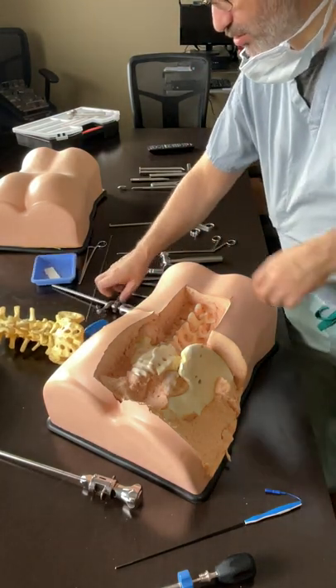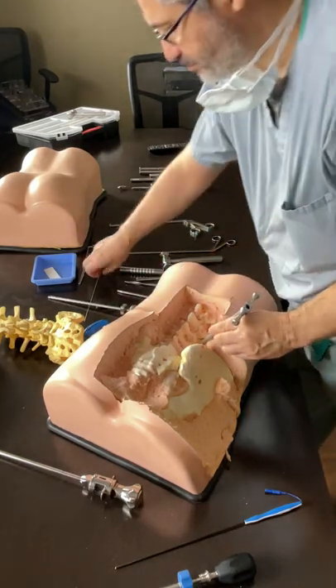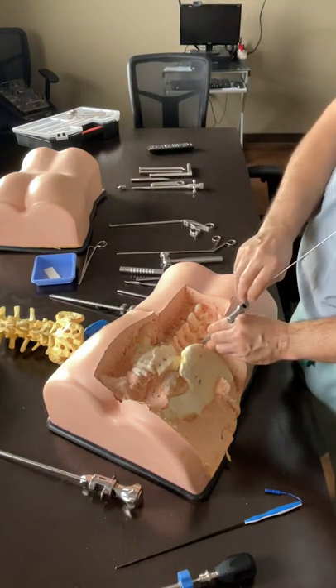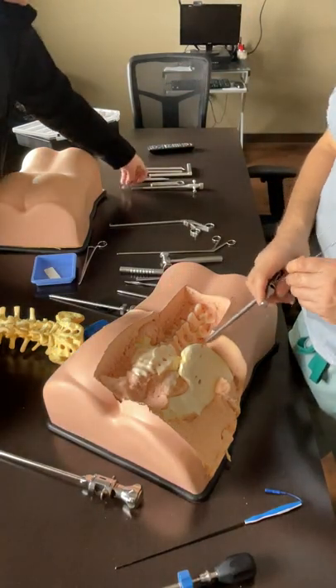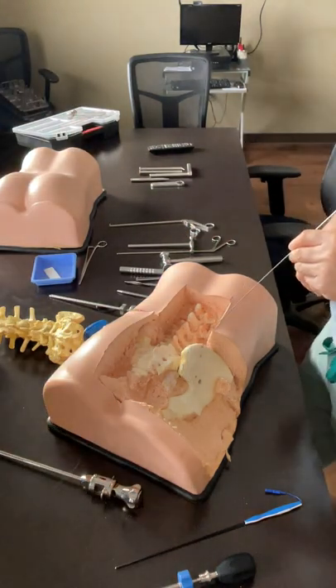Once you have done your discectomy, you put your material in, then your K-wire goes in. I rest the K-wire in the tricalcium phosphate that I have placed in. Now comes the cage insertion.